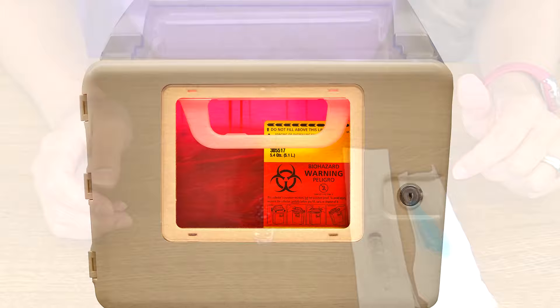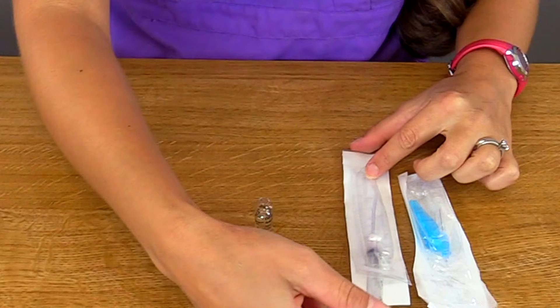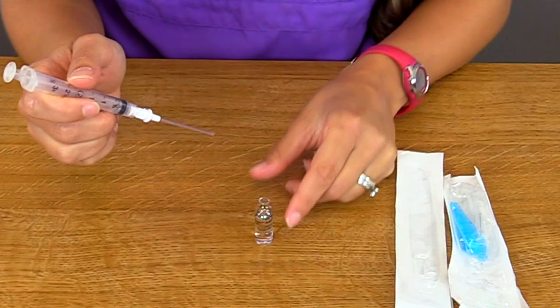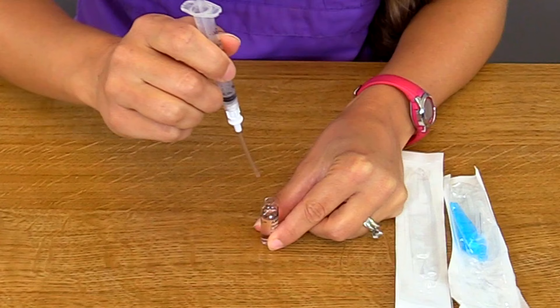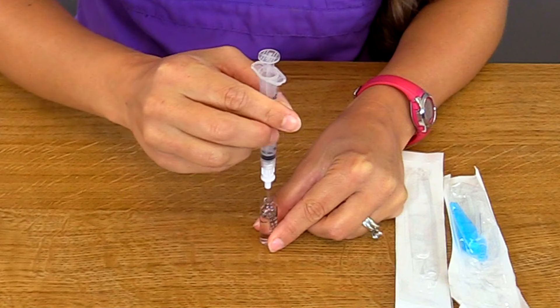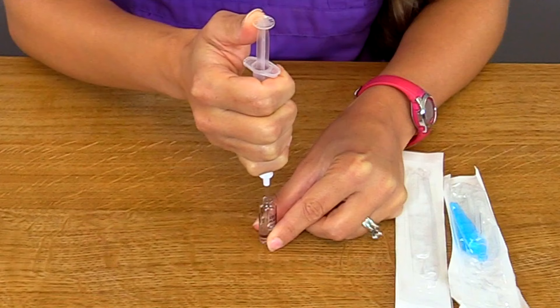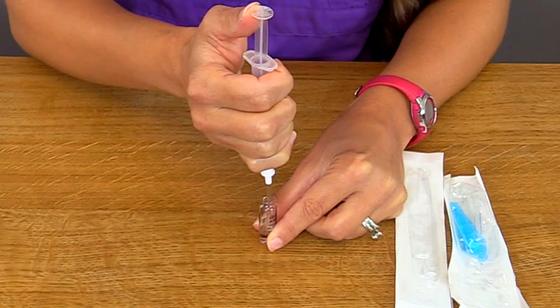Get your syringe with its filter straw and insert the straw inside the ampule. You do not have to inject air inside the ampule like you do with vials. Make sure the ampule is on a steady flat surface and you're holding it with your fingers to keep it steady. Go in the middle and withdraw the prescribed amount of solution — the physician ordered about 1cc here, so pull back until we hit 1cc, going a little over because we have to remove the air from the syringe and then squirt out the excess medication.